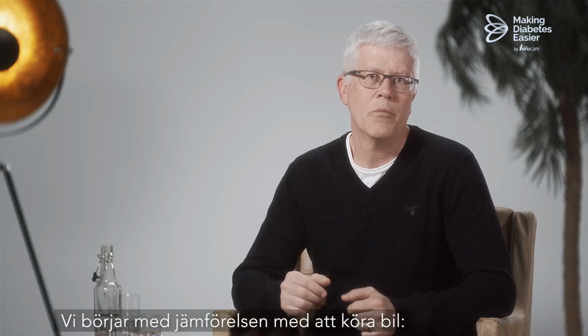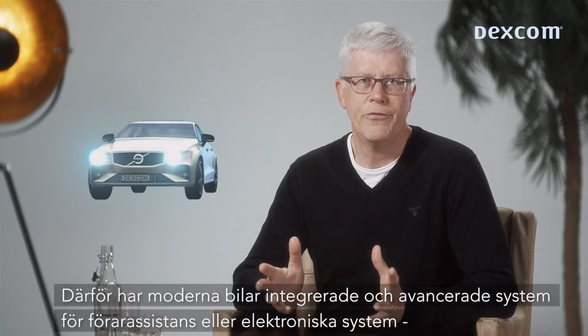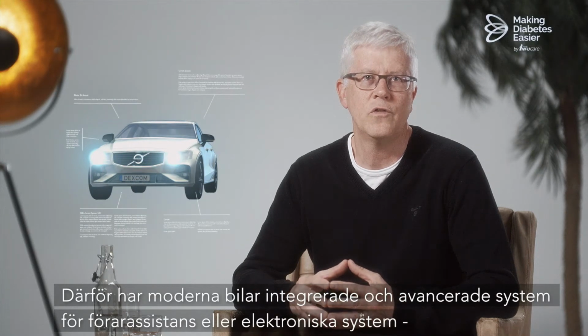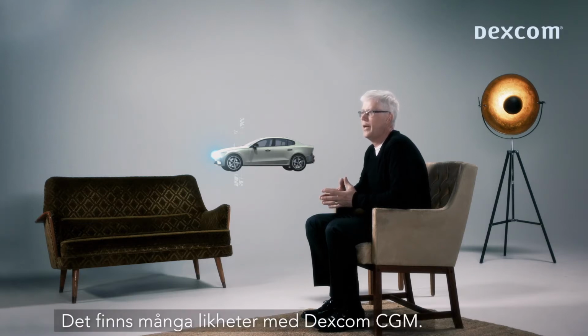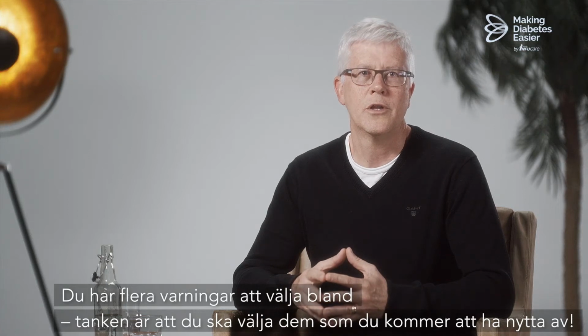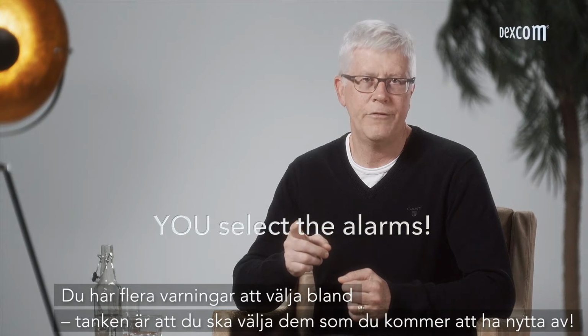We start with a comparison when driving a car. Most road accidents occur due to human error. Therefore, modern cars have integrated advanced driver assistance systems, or electronic systems that help the vehicle driver while driving or during parking. There are many similarities to the Dexcom CGM. You have several alerts to choose from. The thinking is that you select the ones from which you will benefit.